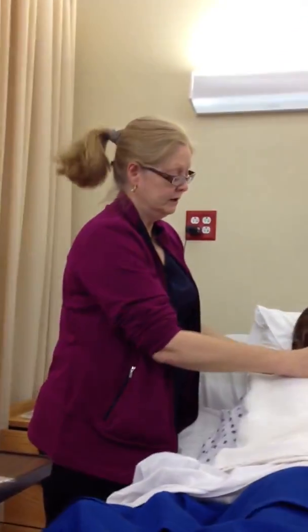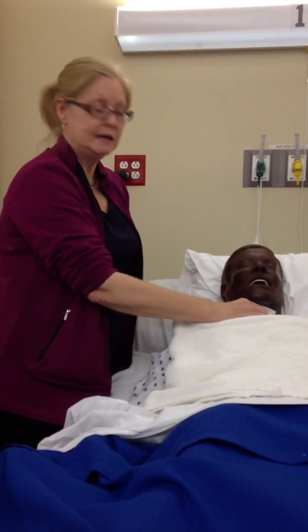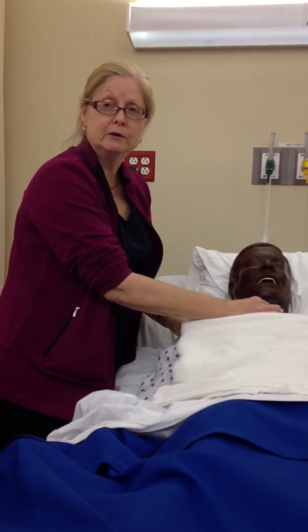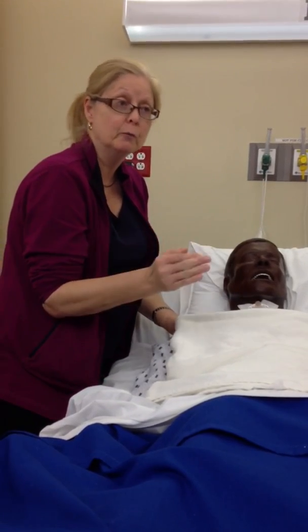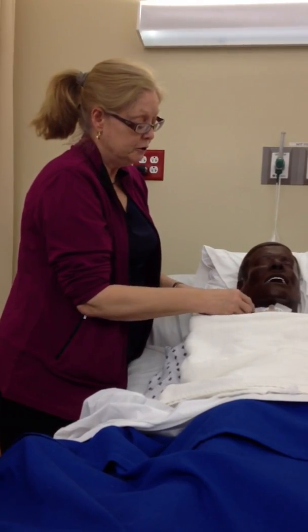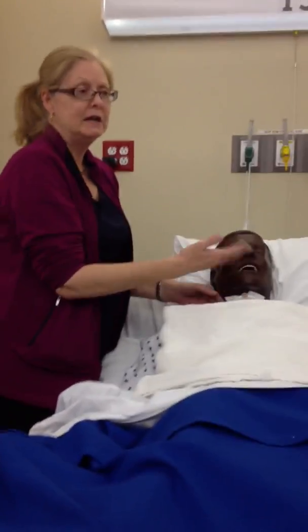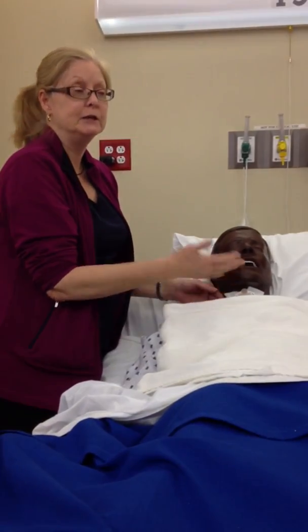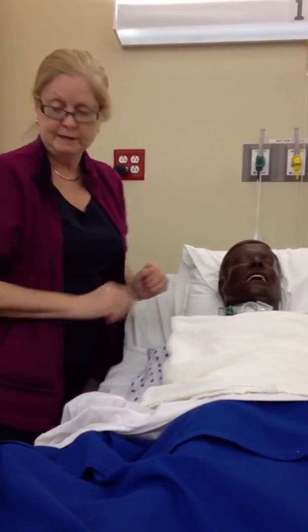because what happens is when you start messing around this trach, if you're just suctioning the trach or you're doing trach care, anytime that you move this trach, it is going to irritate the trachea, and it's going to make the patient have that spasm of the trachea, and they're going to want to cough. So it's not unusual that sometimes you can suction the patient, do trach care, but by the time all that stimulation has taken place, you have to do suctioning again at the end of the trach cleaning, because of that. So leave that there.